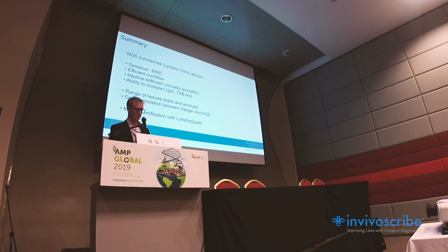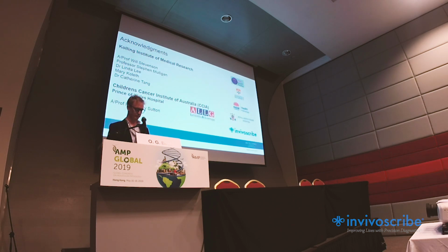We've shown that it can be applied to a range of tissues, including archival tissue, so even formalin-fixed, paraffin-embedded. There's a very good correlation between the NGS assays and direct sequencing. As I said, the thing that we're working on at the moment is MRD quantification using the LymphoQuant assay, and we're going to continue looking at samples from the ALL6 trial.